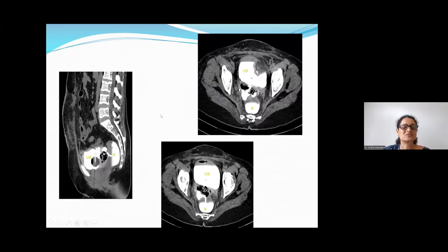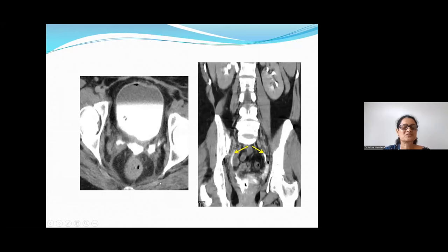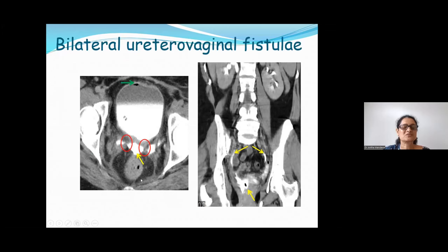Another case with multiple fistulas: a vesicovaginal fistula between the vagina and urinary bladder, and at a lower level a rectovaginal fistula — double fistulas in the same patient. Another case of carcinoma cervix: both lower ureters communicating abnormally, with contrast seen on both sides of the vagina — bilateral ureterovaginal fistulas. Air within the urinary bladder is again the indirect clue. Coronal views are better for evaluating ureteric fistulas.